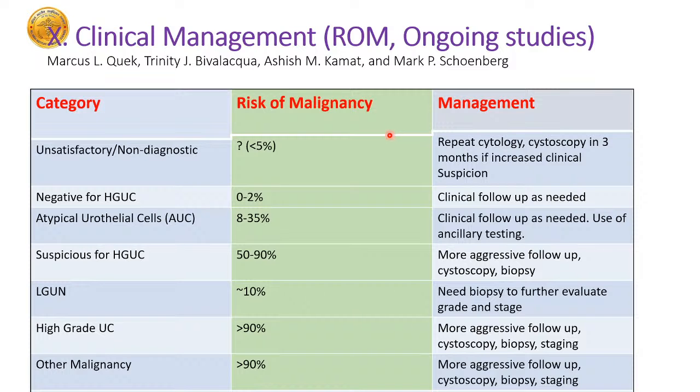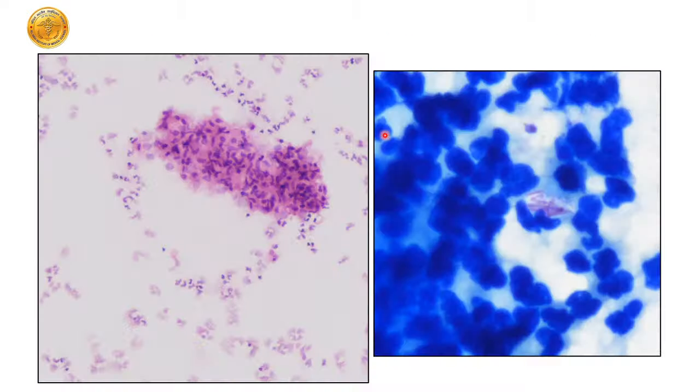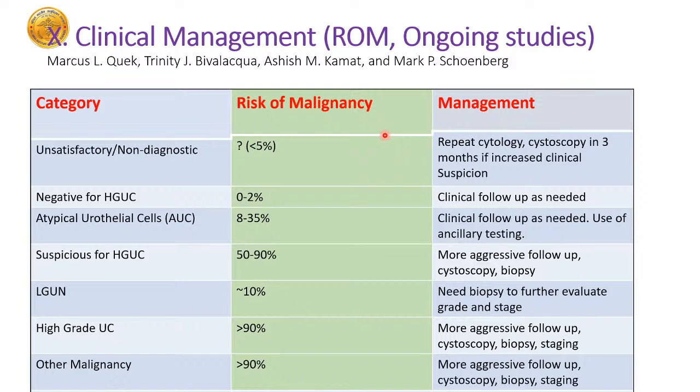So just remember, the moment you say something is negative, the patient is clinically followed up, unless the patient is not improving clinically, comes back with gross hematuria, and the clinician feels that there is a need to repeat. Next slide, please.